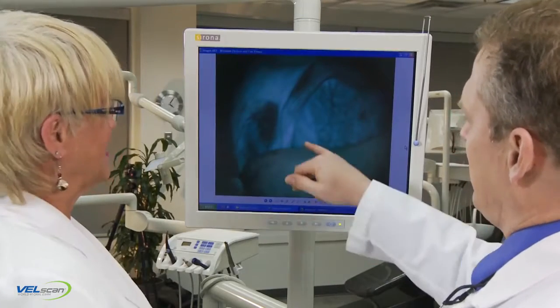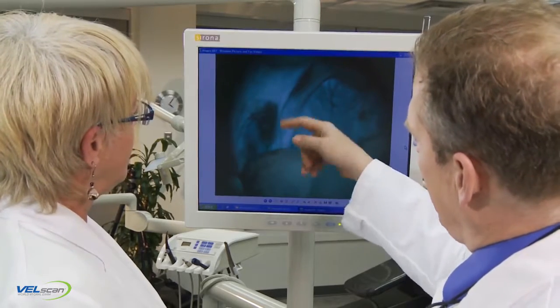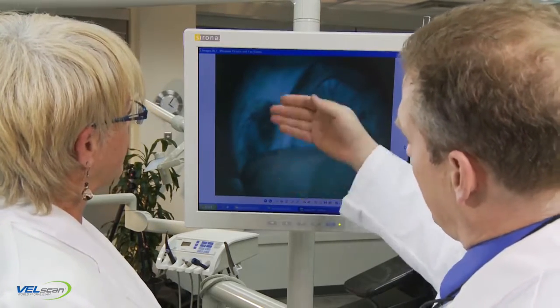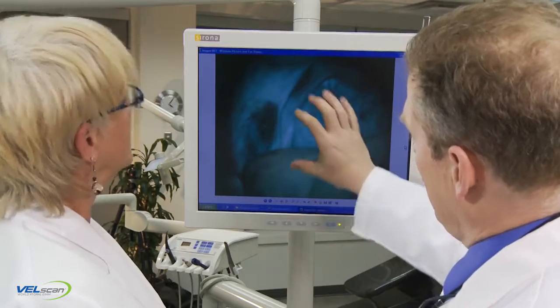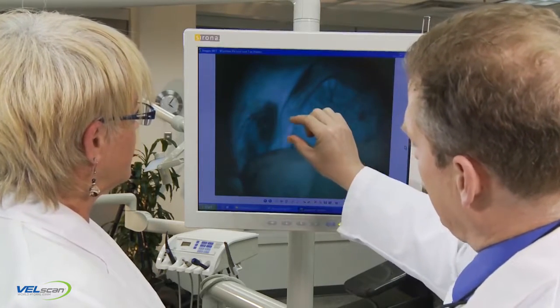Your clinical judgment will ultimately determine the appropriate course of action. Persistent abnormal findings should never be ignored, and should be followed until they either resolve or their cause is well understood. Emphasize to the patient, however, that persistent abnormal findings do not necessarily indicate cancer.